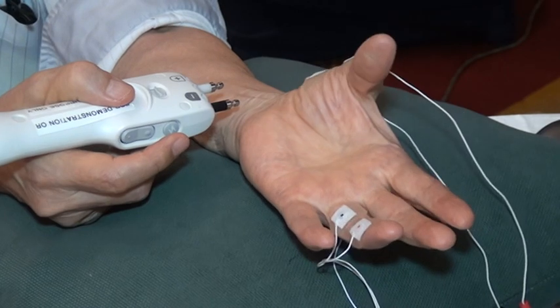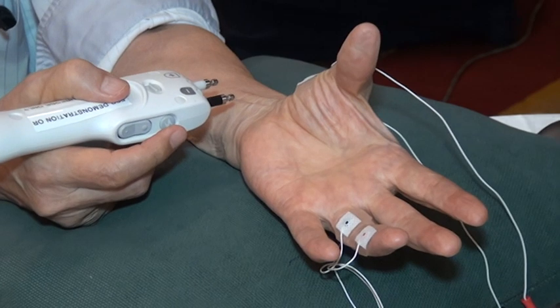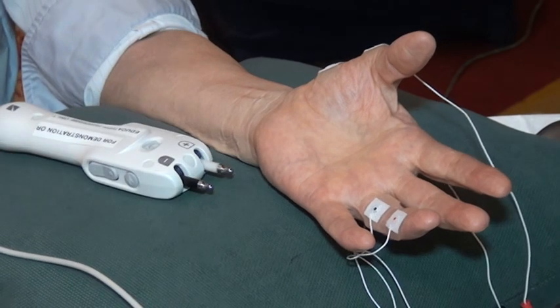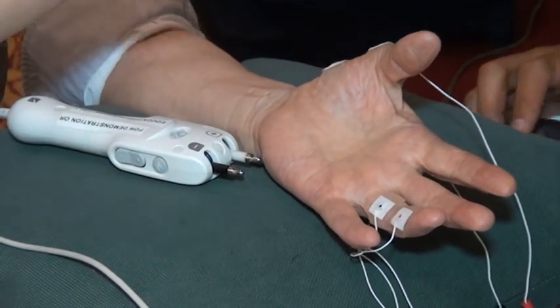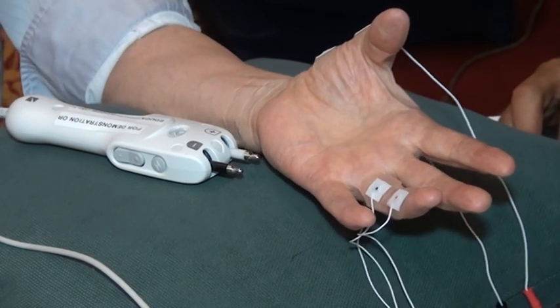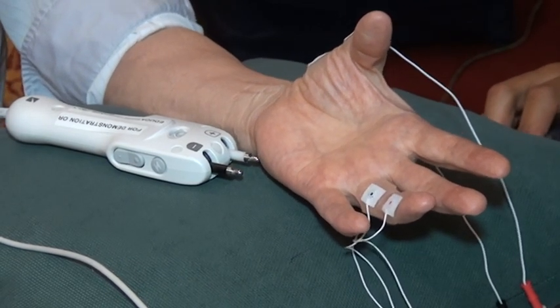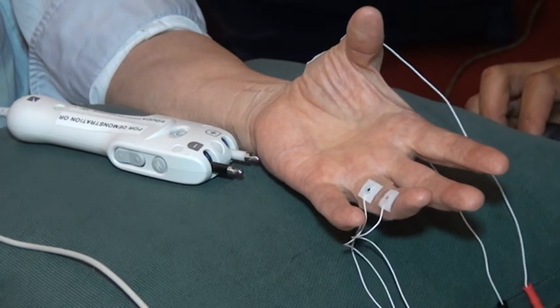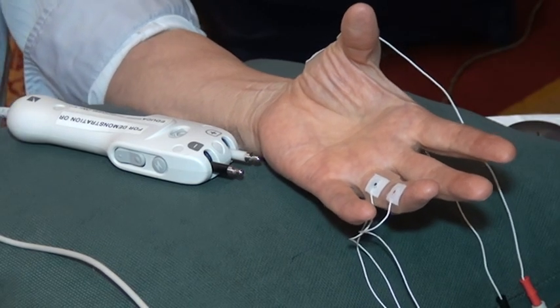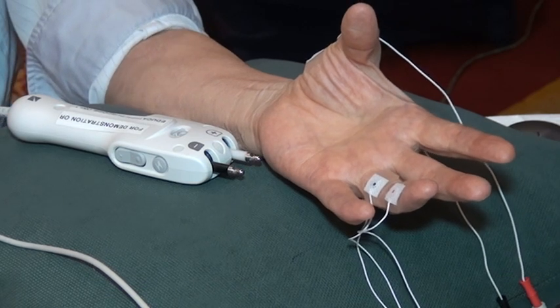When I move, actually I'm shortening the abductor pollicis brevis. If you shorten the muscle, what you record on the screen here, the big response, is a compound muscle action potential. It comes from all the motor units in that particular muscle. That's why it's called compound muscle action potential. And when you shorten the muscle, motor unit potentials become synchronized. If they synchronize, the duration becomes shorter and amplitude becomes higher.